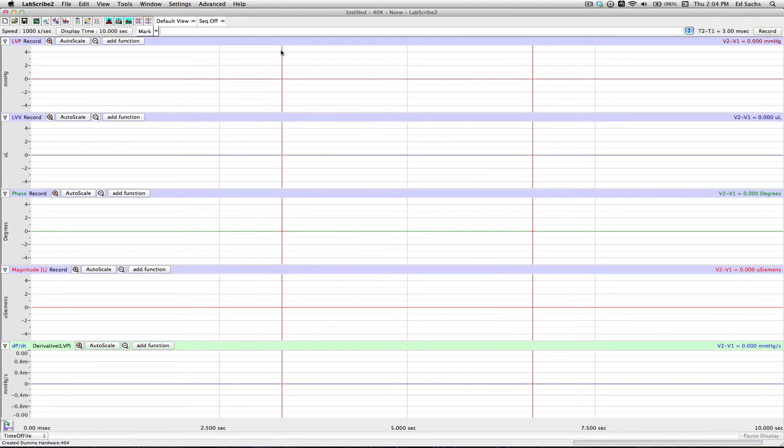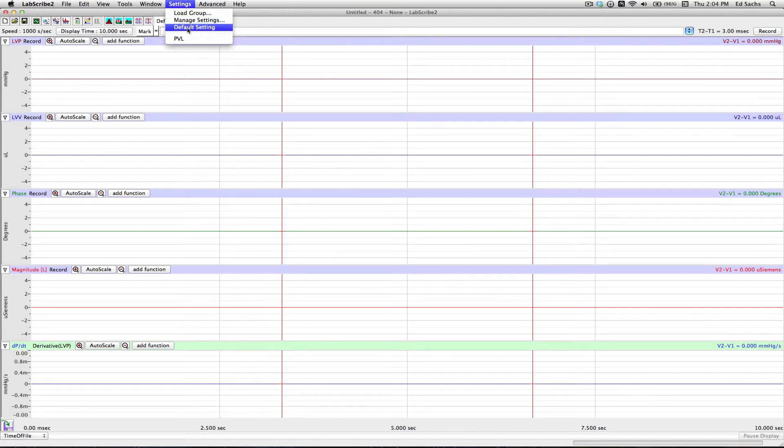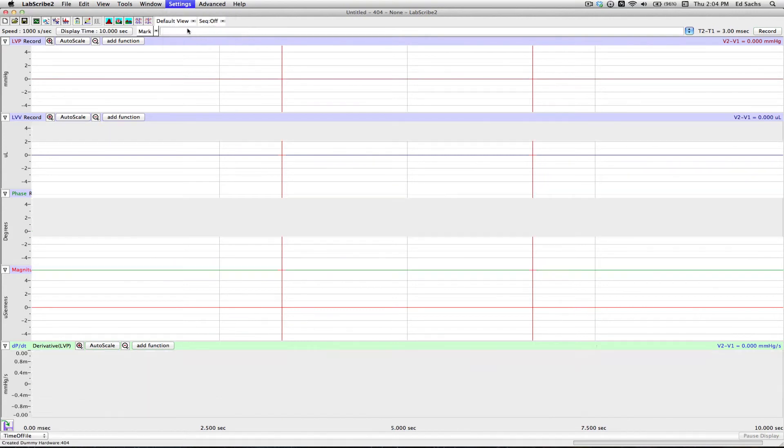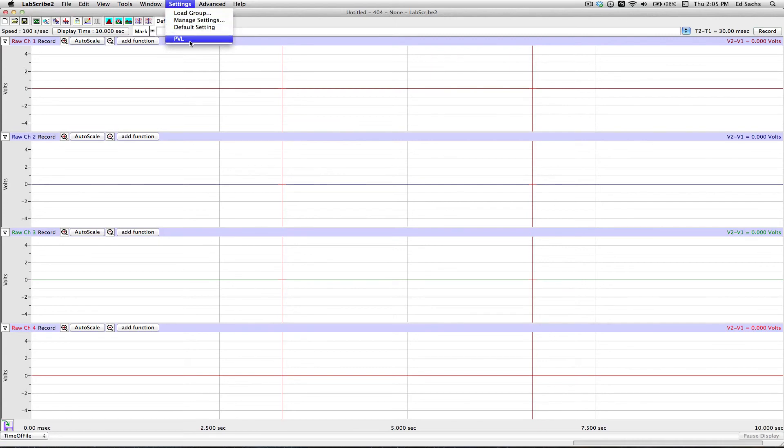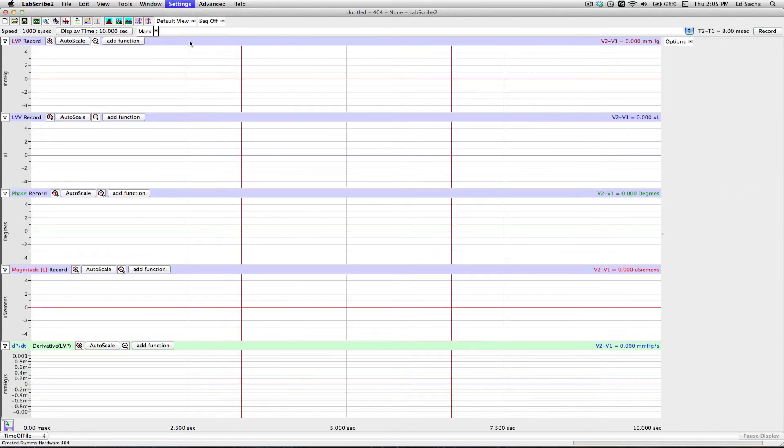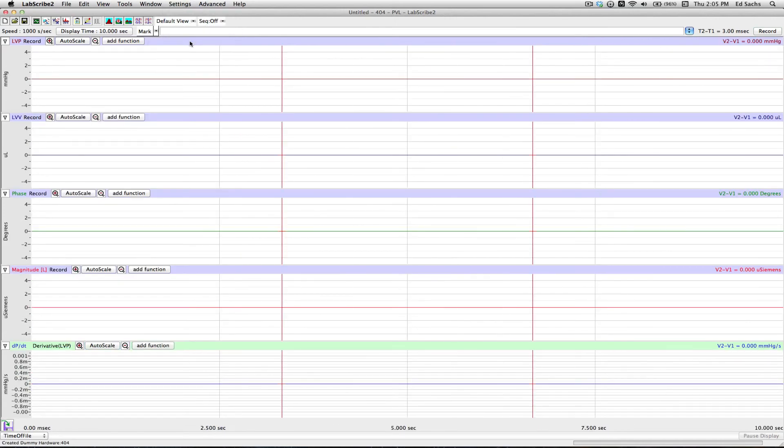Now when we bring the Settings folder down, there's our PVL on the list. Just to show you, there's our default, the way we started things. I select PVL, all our settings get put into place as our protocol, and now we're ready to record.